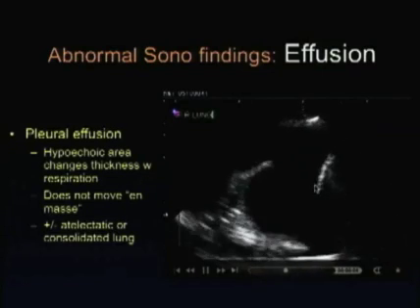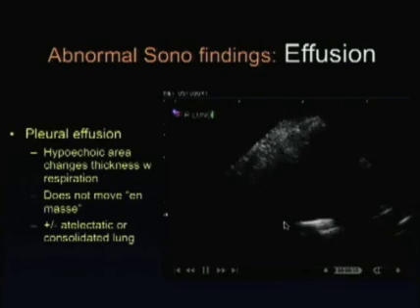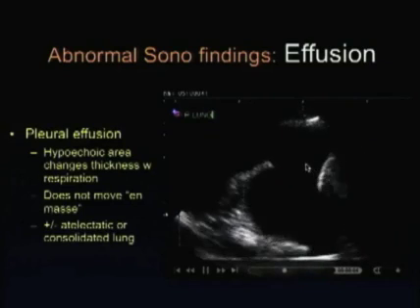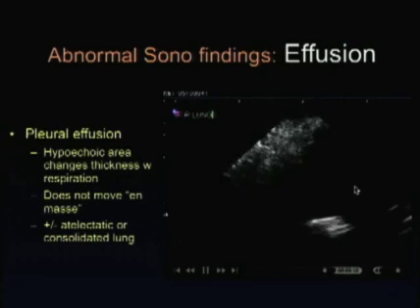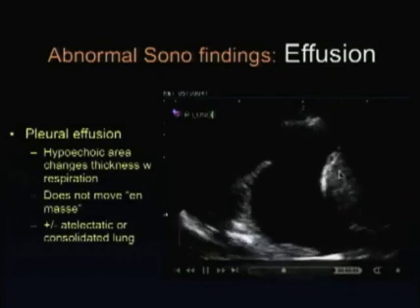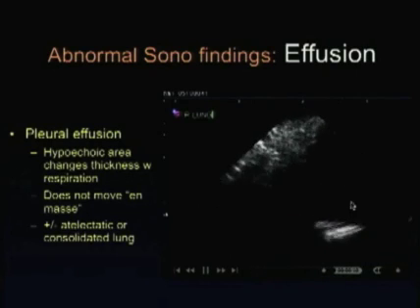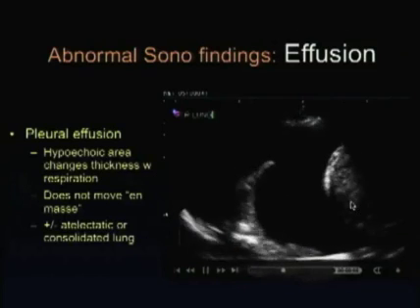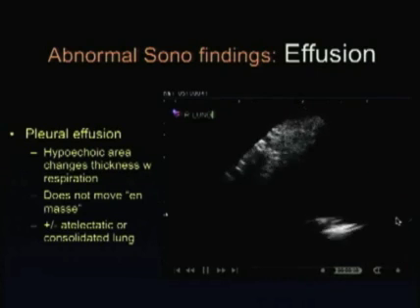Of note, the diaphragm is much harder to see adjacent to an effusion, and sonographers with less experience sometimes mistakenly call these effusions, especially if they're a little smaller, subphrenic, because they're unable to identify the diaphragm as clearly as they used to in many ultrasounds. In fact, the bright white line of the diaphragm is mainly caused by adjacent lung. So when the lung is taken away, the diaphragm gives a much weaker echo signal, and it's sometimes impossible to see at all in some areas, as can be seen in this example here.